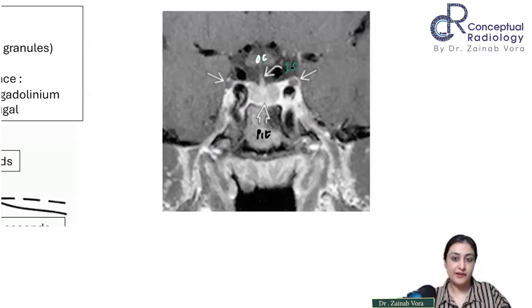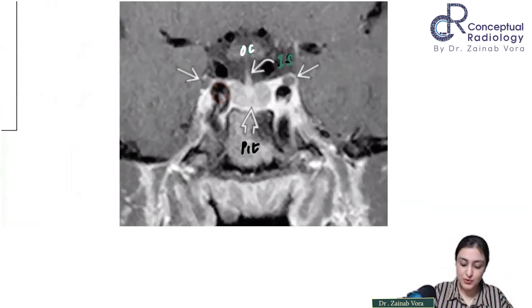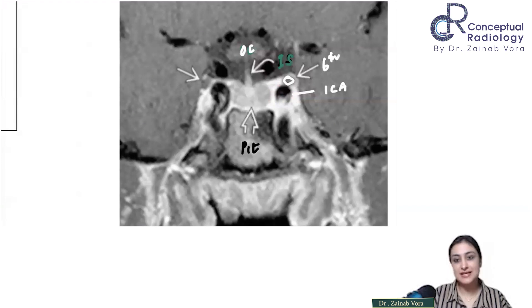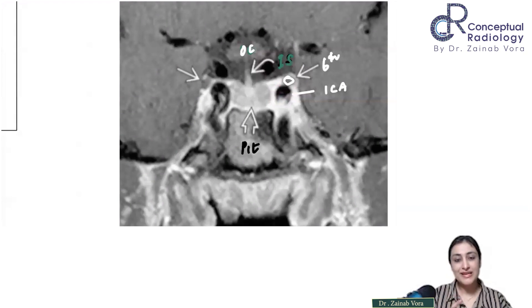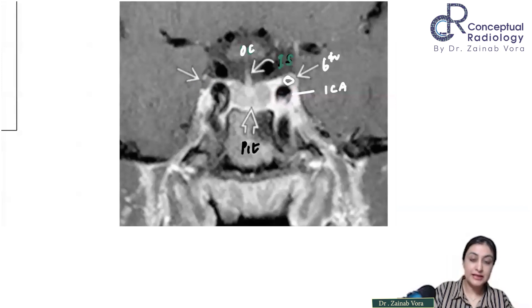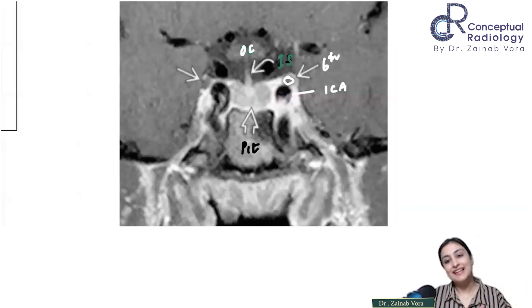What are the contents of the cavernous sinus? Very important. There are two structures within the cavernous sinus itself: the flow void corresponding to the cavernous segment of the ICA, and the sixth cranial nerve running within it. In the lateral wall lie three other cranial nerves — the third, fourth, and V1 — which may be visible on very high-resolution thin-section images but are not well seen on standard post-contrast images.